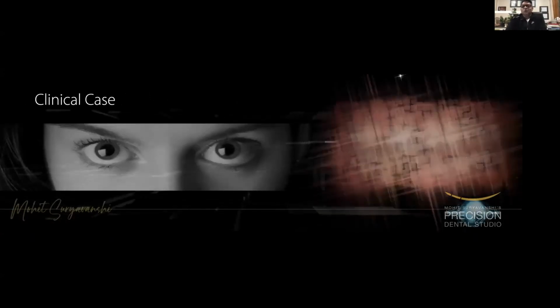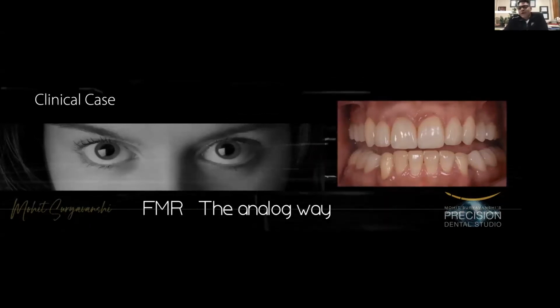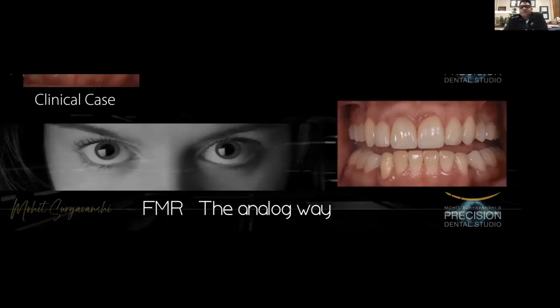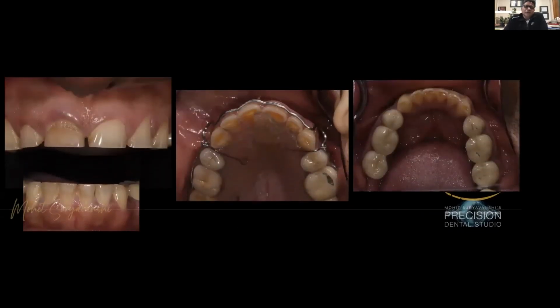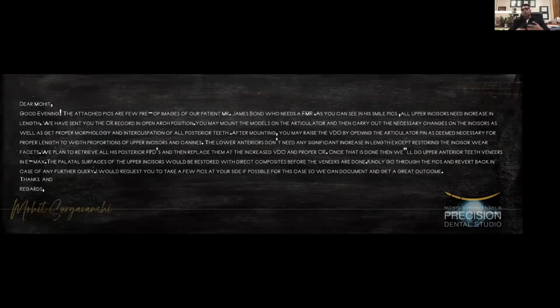So one more case I would like to show you, wherein we have done a full mouth rehabilitation the analog way. That's how the images first came to me by email, and then came a note which the dentist prescribed. He had some requests about what has to be done. A very, very renowned and very knowledgeable dentist, and I'm very fortunate to work for him. So cases turn out really good.